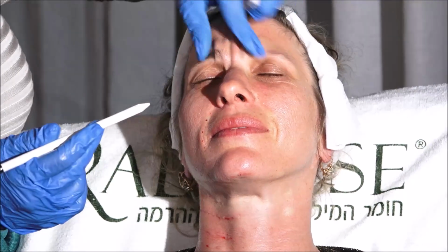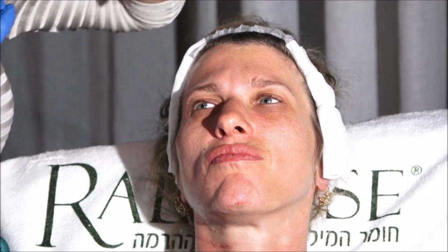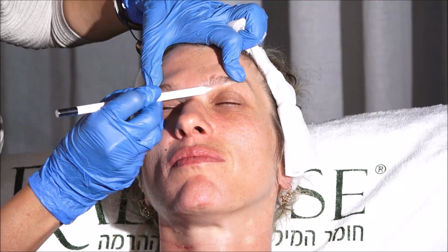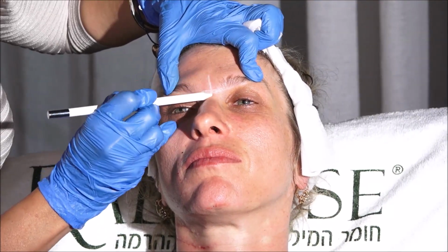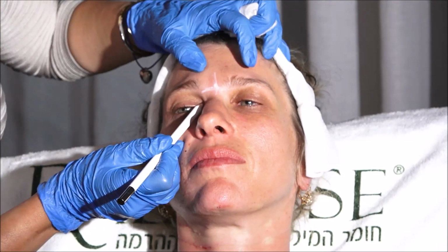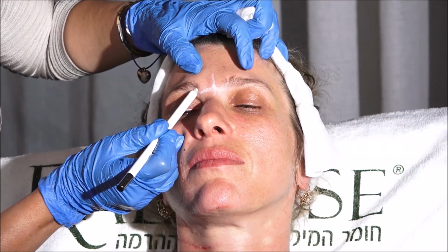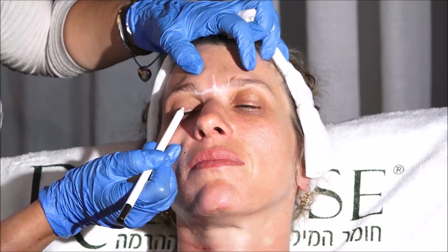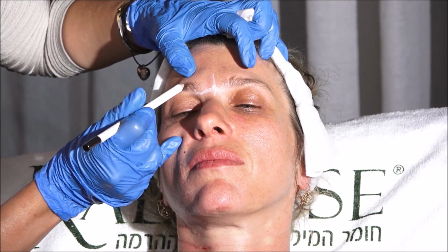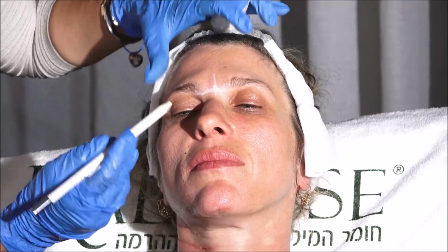Let's see her glabella. Can you frown for me? Strong. So if you see her frowning, she has a typical straight U. So if you put the line in the lower brow like this and midline, her point will be exactly here for the procerus. Canthus to the lower border of the brow. So my point for the corrugator will be here. The next one will be in the limbus in the middle of the brow. The next one will be in the pupillary line up here. So those are the basic points, and this one is a support point.